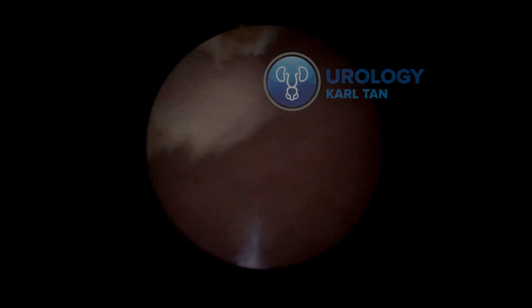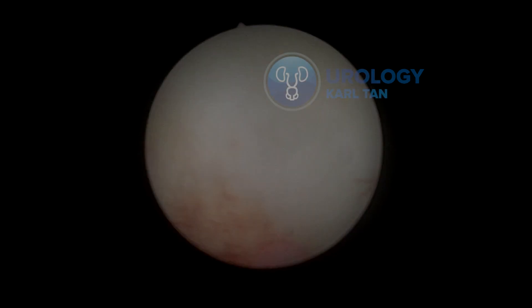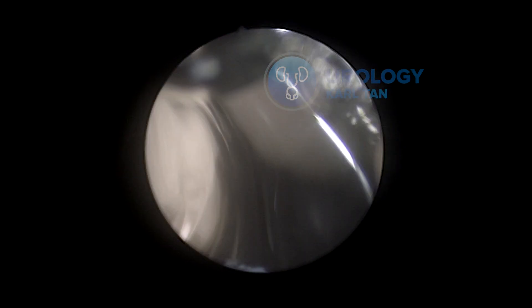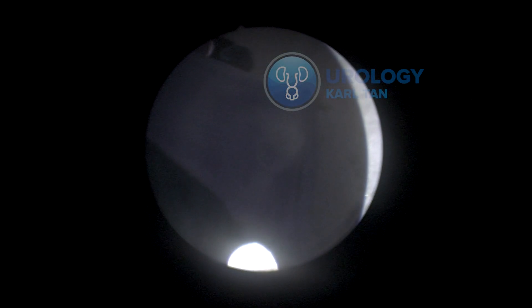So that's our sphincter. We're going to start with morcellation shortly. We leave the outer sheath and change into the morcelloscope.